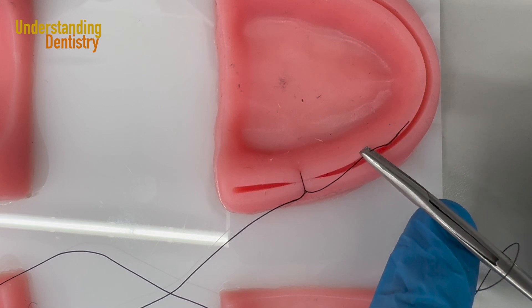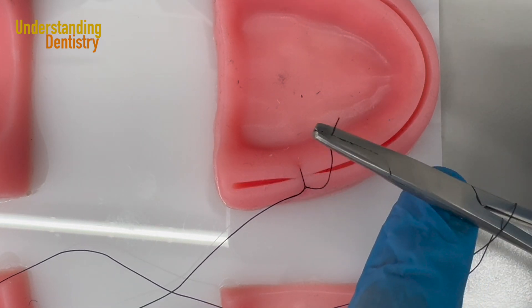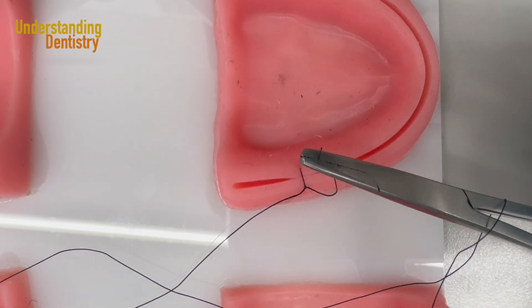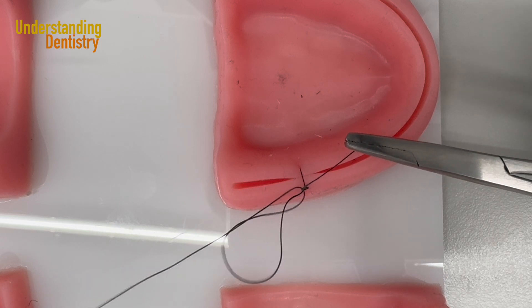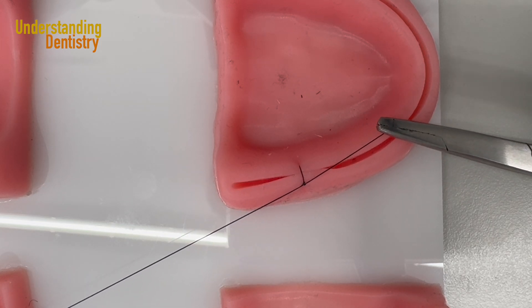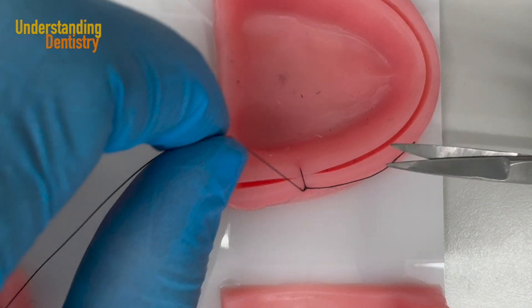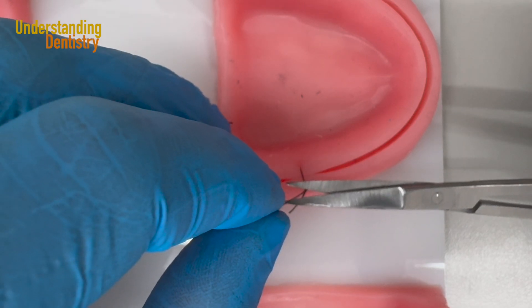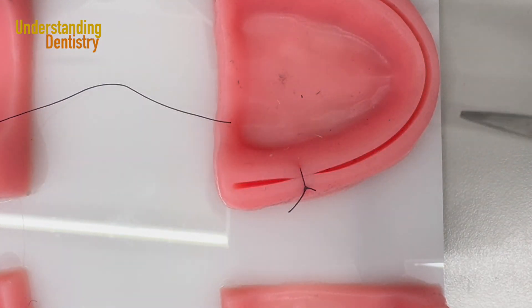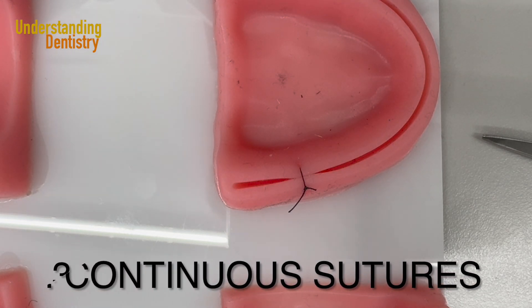I grab the tip of the thread — the closer to the tip the better. I grab closer to the tip and pull only with the hand holding the needle. The suture is now finished. I need to cut both ends. Of course you will have a tweezer to help with this procedure. That's your interrupted suture — now let's go for a continuous suture.